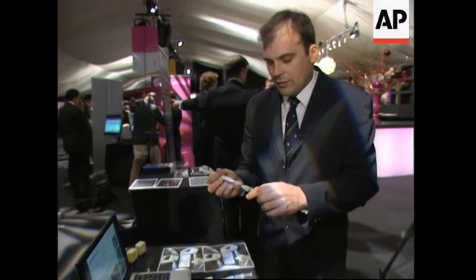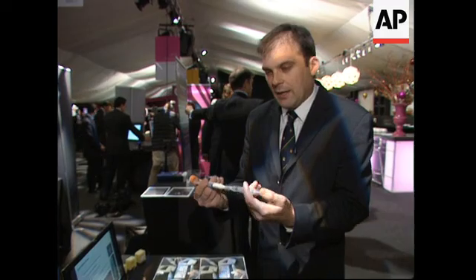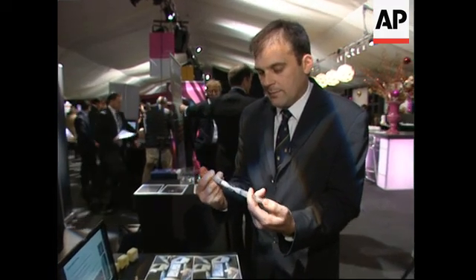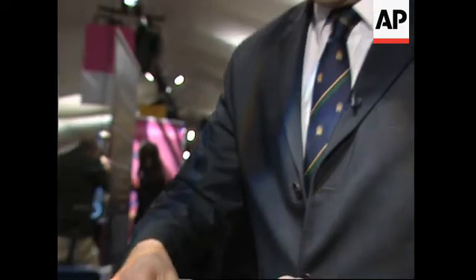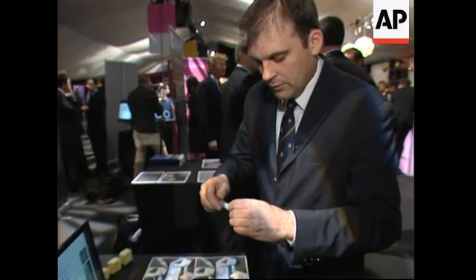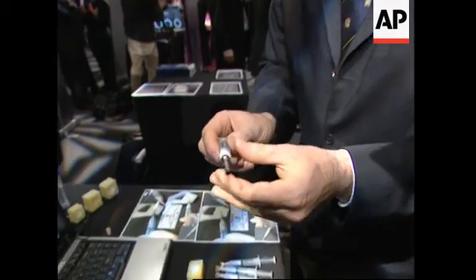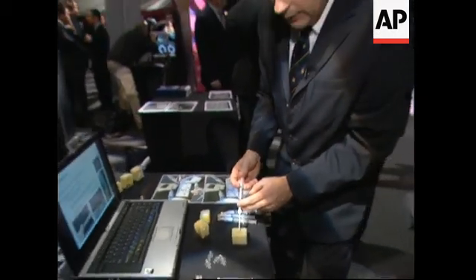We couple the two syringes together, and then we add the liquid into the powder. Okay, so the next stage then is to add the needle, which you're going to inject into the body with. And at that stage, we're ready to inject into a cavity. Here we have something that looks like bone, and we can inject it in.